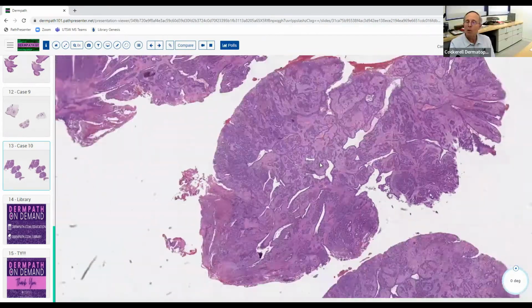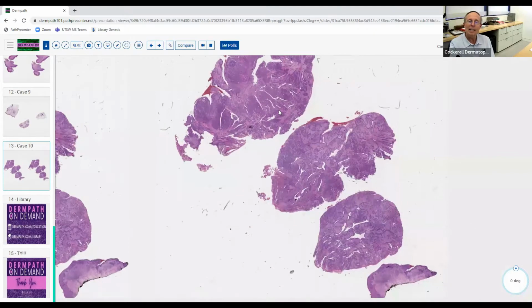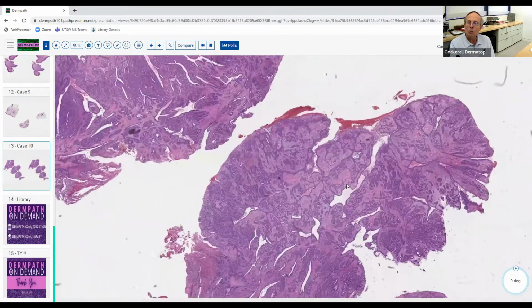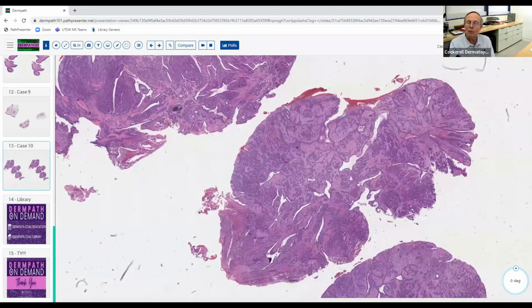Well, sometimes when you get a multi-lobulated lesion like this, you have to look at one of them at a time. So if we just look at this one right here, let's forget these two for the time being. It almost looks like it shelled out, didn't it? There's no overlying skin, so it's probably a dermal lesion. And if you look at the individual one here, it's pretty symmetrical. You can draw a line around it, it's pretty well circumscribed.